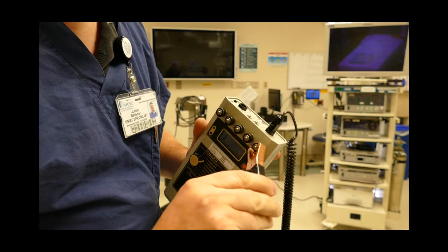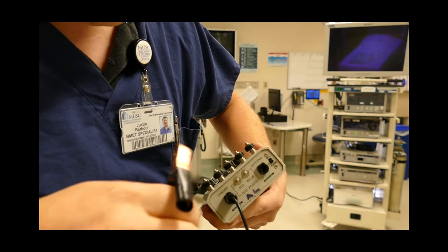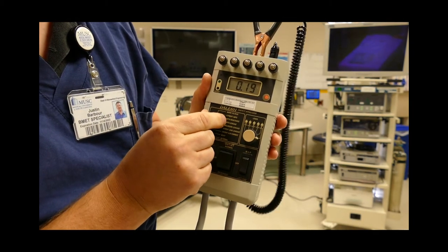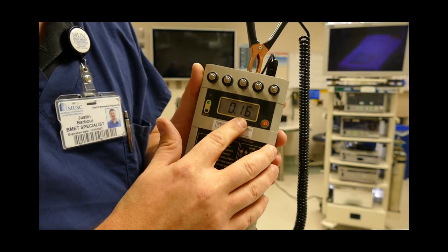We're going to set this up on 0.15 ohm — you can see it right here. Connect it, and your dial is going to be on earth resistance. On the meter it should show pretty close to 0.15 of an ohm.